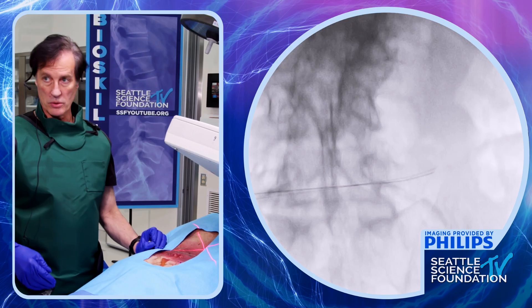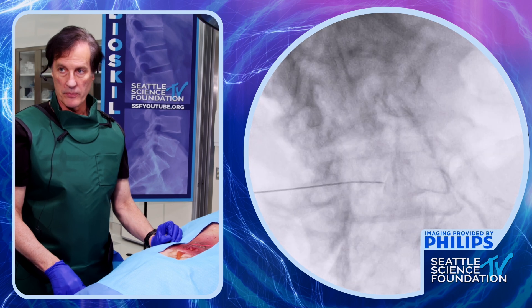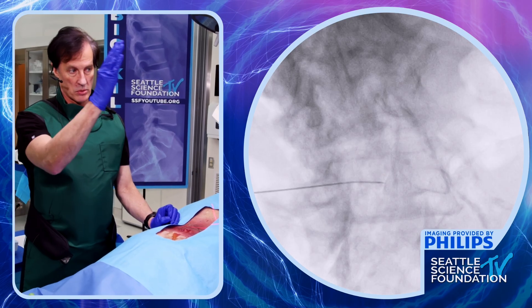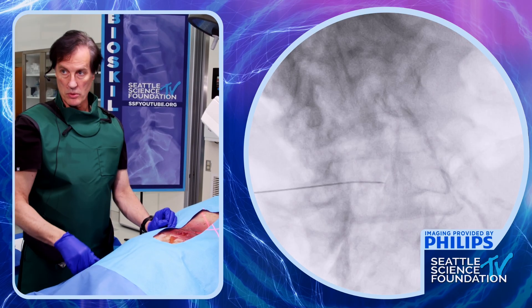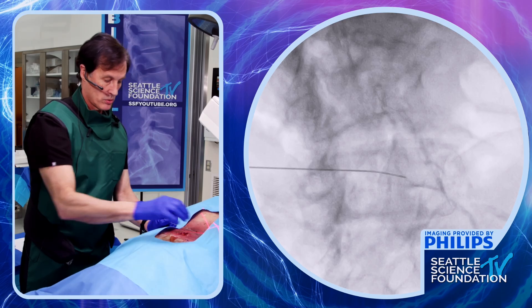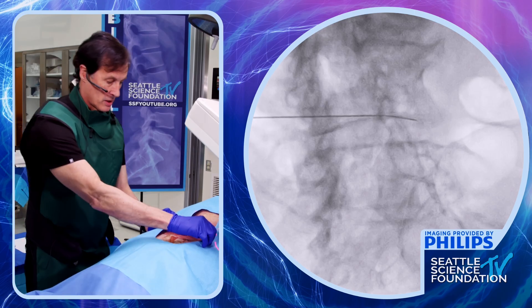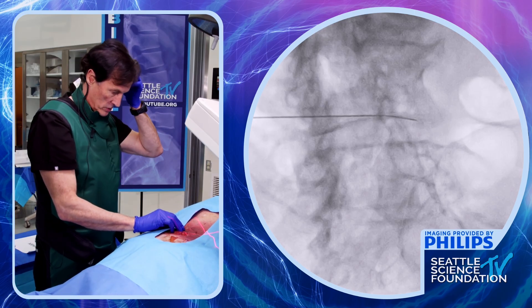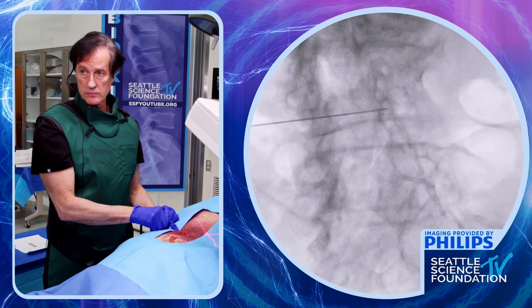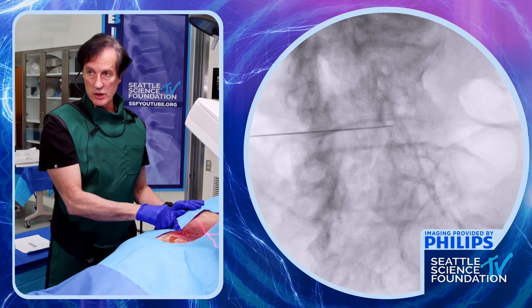I'd like to work on trying to get these radiographs orthogonal. Good, here we go — come back a bit. We'll see whatever disc this comes up to. That's very good right there.